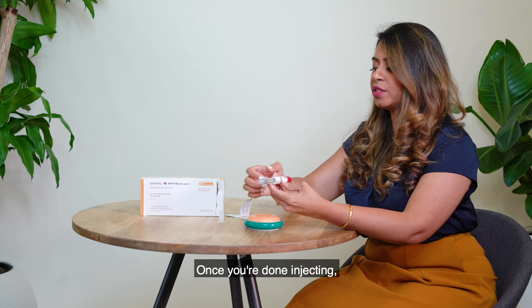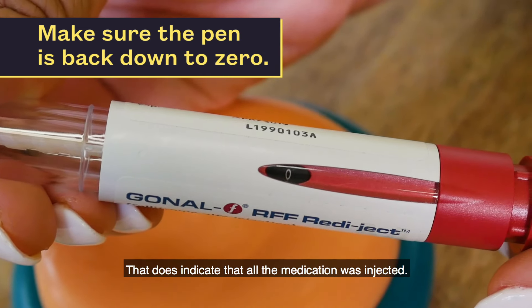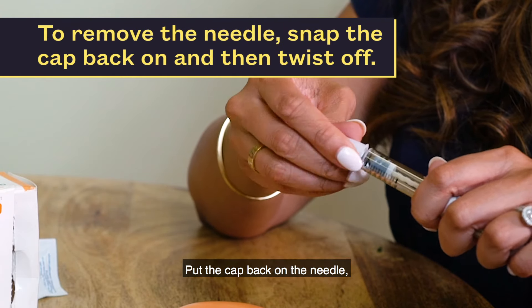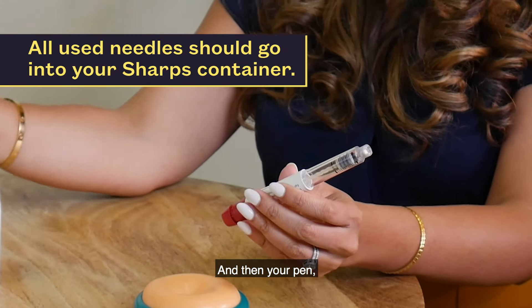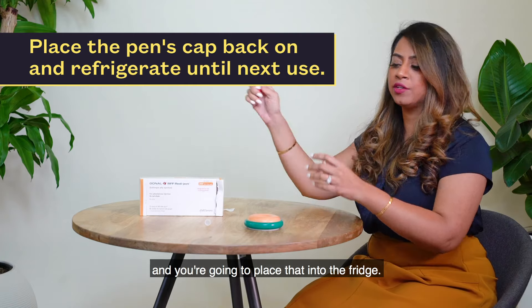Once you're done injecting, always double-check that the dial comes back down to zero — that does indicate that all of the medication was injected. Put the cap back on the needle and remove the needle. That's going to go into the sharps container, and then your pen you're just going to put the cap on and place it into the fridge.